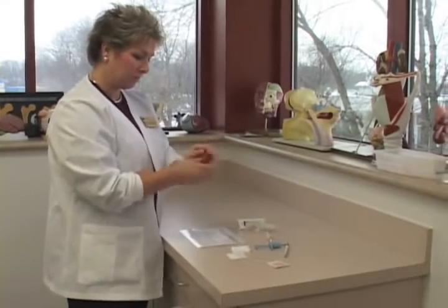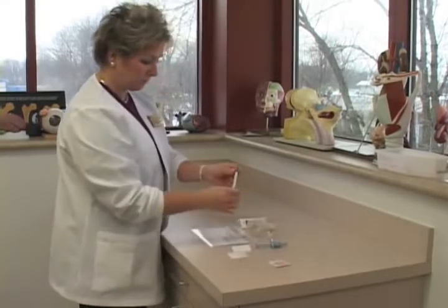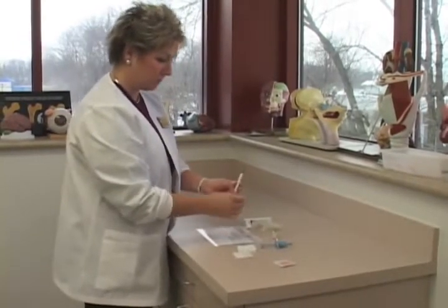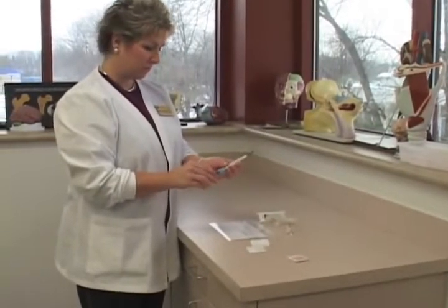Prepare ordered medications correctly using appropriate syringe and needle combination. If using medication dispensed in a pre-filled cartridge, for example a Carpujet, add appropriate gauge and length needle.